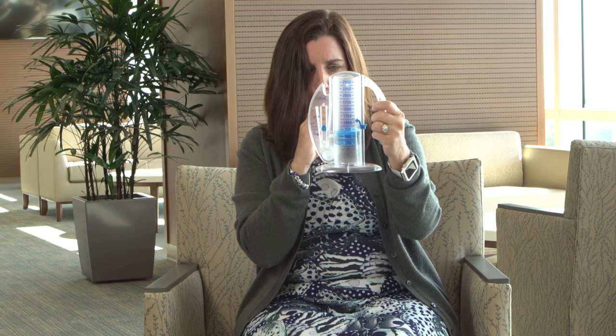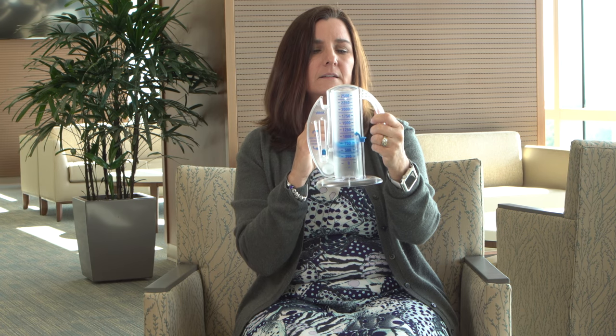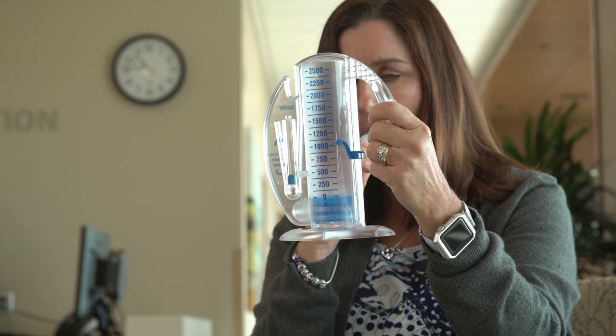Hold your breath as long as possible. Then, exhale slowly and allow the piston to fall to the bottom of the column. Rest for a few seconds and repeat.